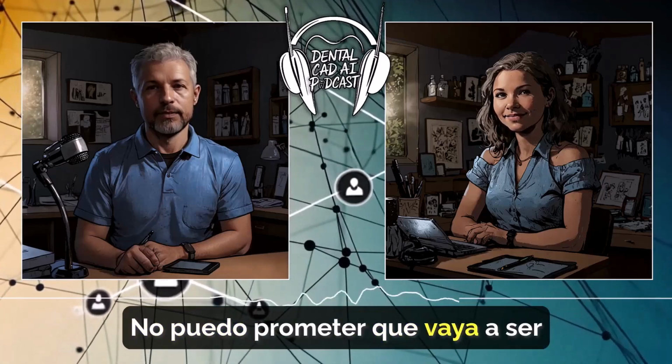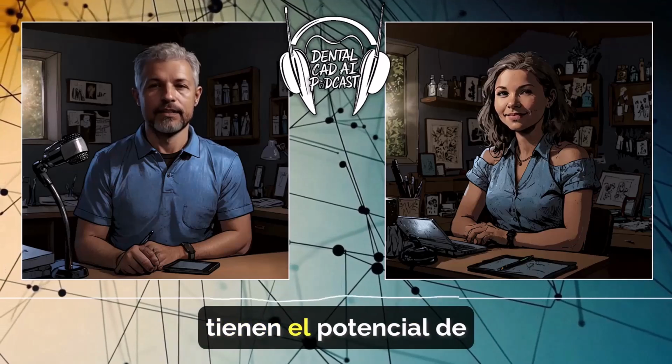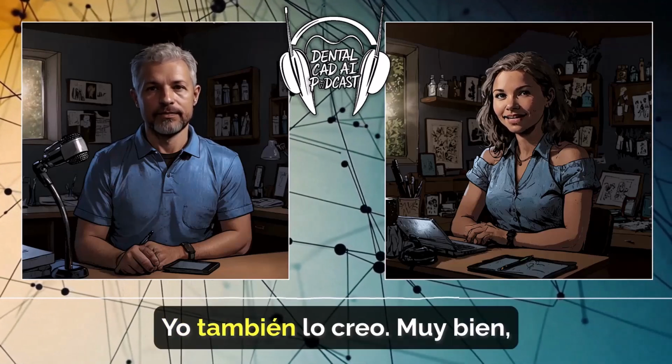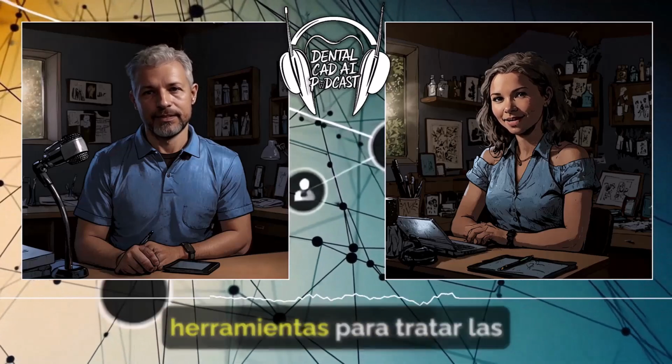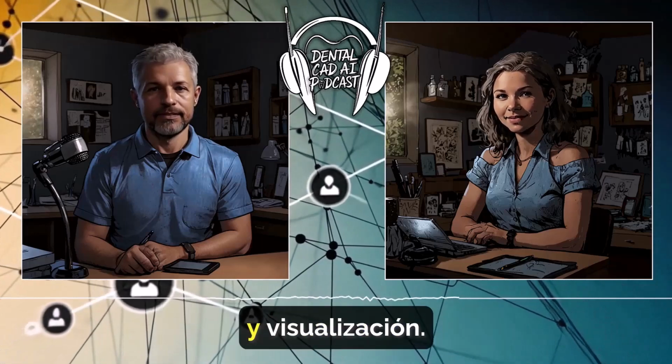I can't promise it'll be everyone's favorite outing, but I do think these advancements have the potential to really transform the way we experience dental care. I think so too. All right, so let's do a quick recap. We've talked about efficiency upgrades, tools for dealing with imperfect scans, improved collaboration, and visualization.